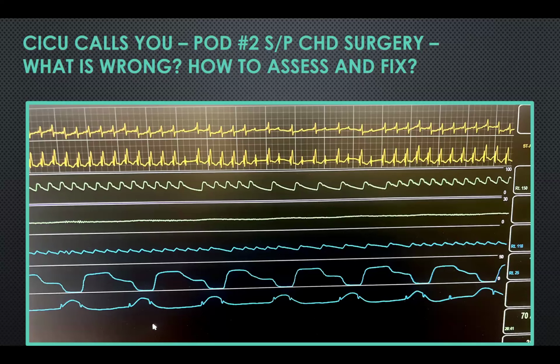My understanding is the permanent leads that you put in, you kind of adhere to the myocardium, and then it also gets epithelialized and more secured, and there's more contact with the leads in the myocardium. Whereas with these temporary leads, they're often epicardial, or there's sometimes edema or swelling postoperatively that can also change their efficacy. Yeah, right.